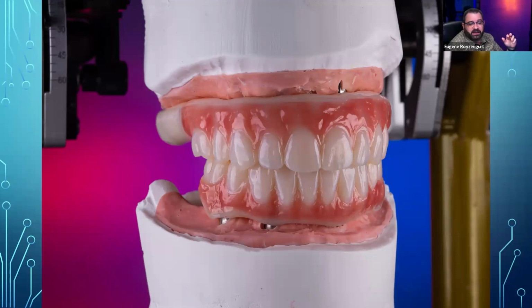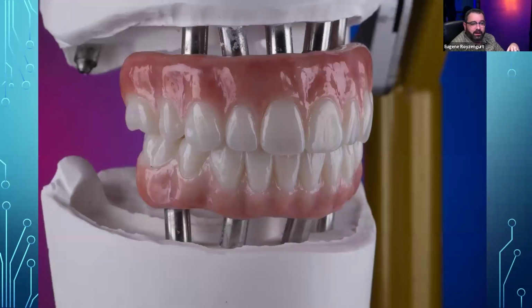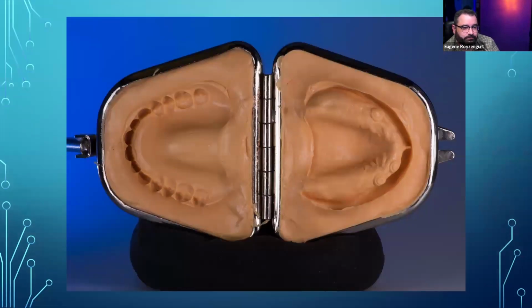And I'll put prototypes in. We usually wear prototypes anywhere from 2 to 6 months. And from there, we'll transfer the patient into a zirconia case. This particular one was done like this: I did the setup, basically. I use a lab in Ukraine that does my digital design. And then I'll print the prototypes, and then we'll mimic the prototypes to do the final. And my best friend, Vadim, does all the ceramic work for me, finishing. And my dear friends at Alien Milling do all the milling for me for these cases, okay?